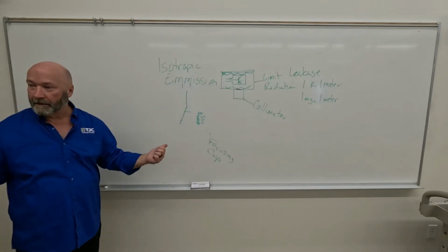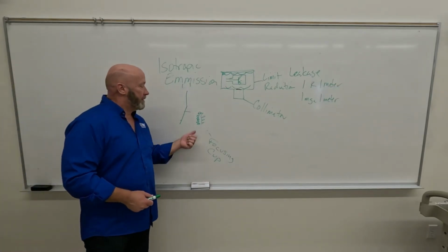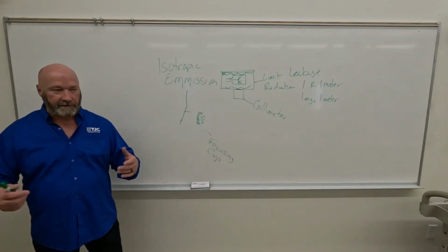They're trying to repel from each other, right? They're trying to push each other as far apart as possible. The more we push onto it, the harder they're trying to push from each other.